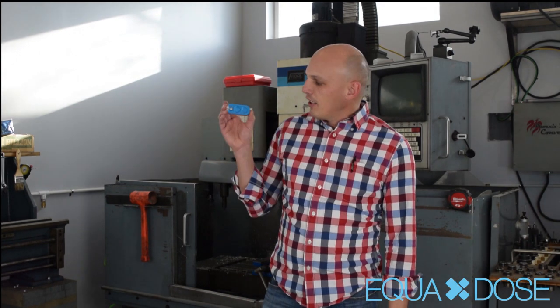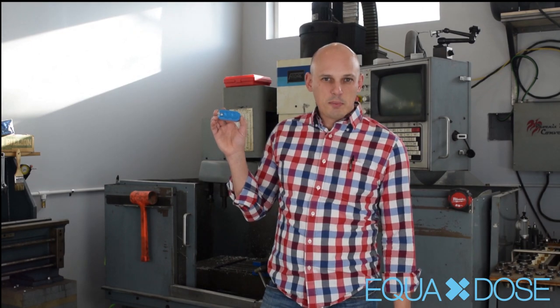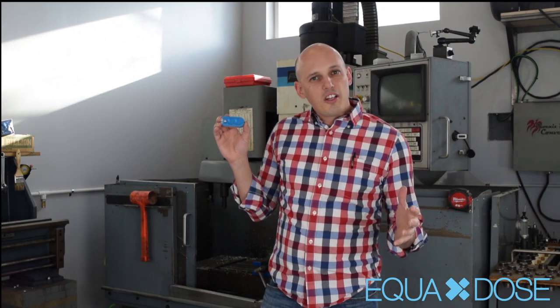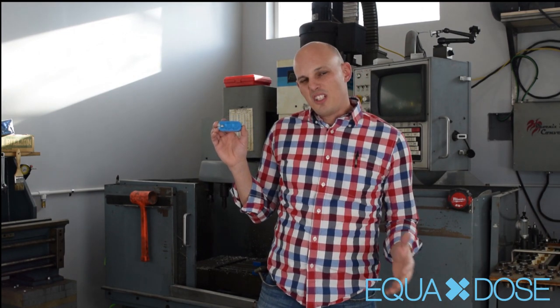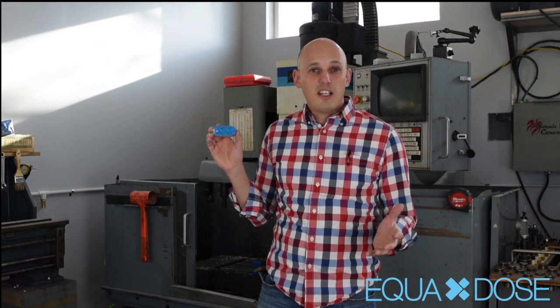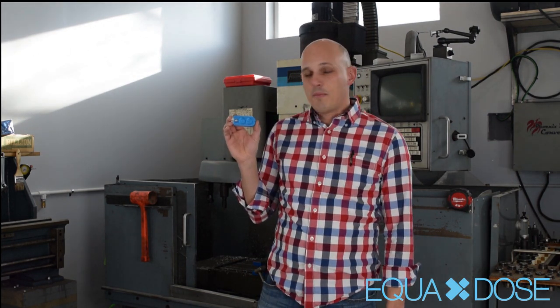Hey, welcome to the Equidos shop. This is where we do a lot of our product development and we really do most of our manufacturing as well. Today, we wanted to go ahead and show you our pill splitter, the double-plated pill splitter. It's quite a bit different than your typical pill splitter. We want to take the opportunity to go through maybe some tips and techniques, split some pills, show you how it works, and maybe help you get a better idea of how to make it work for you.